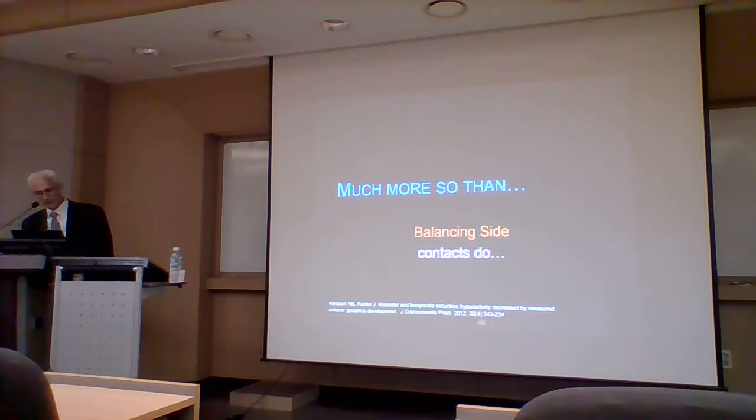In 2012, we published a paper that analyzed 45 dysfunctional subjects, treated them also, and we determined from that with the T-scan EMG that the most common high muscle firing element was working side group function.